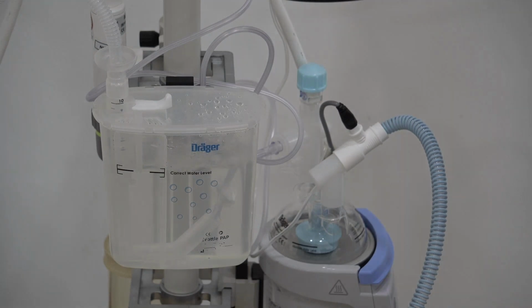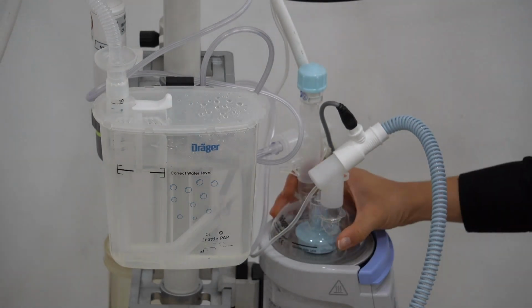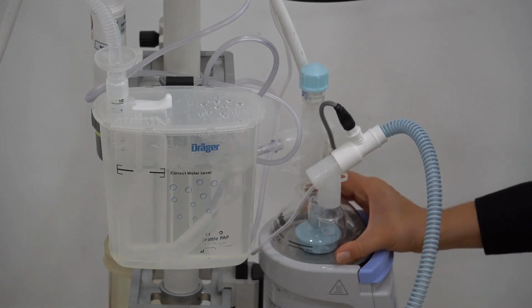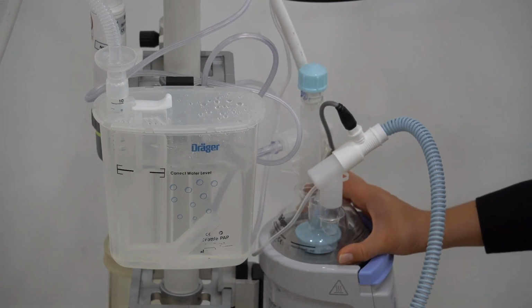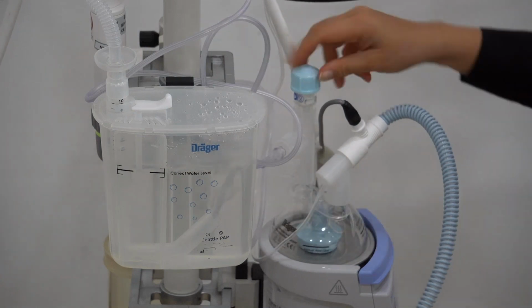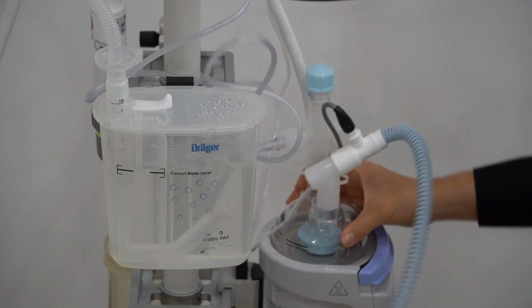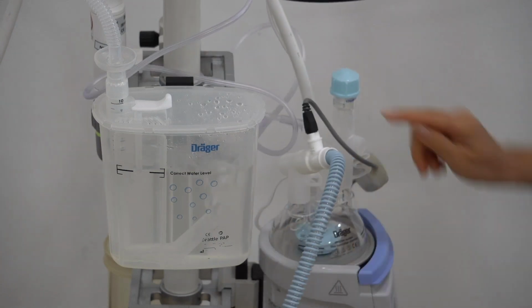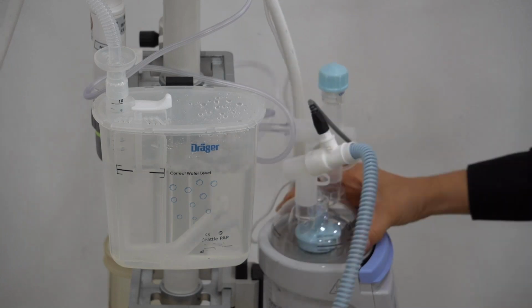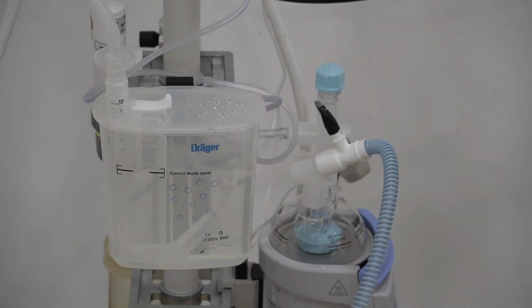So we have the connection here to the humidifier. You can use any humidifier that is available in your hospital. We also have a safety valve. This safety pressure valve is at 17 centimeters of water. That means the pressure that is delivered to the baby will never exceed 17 millibar.